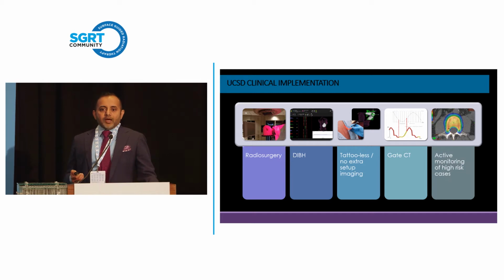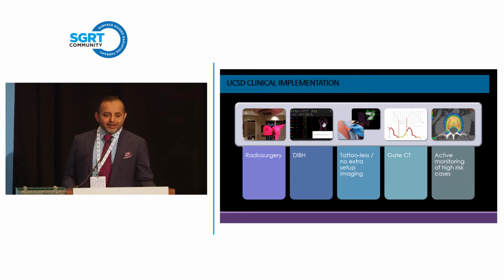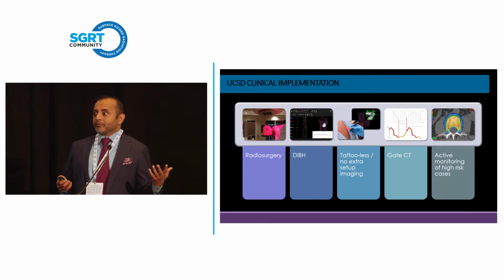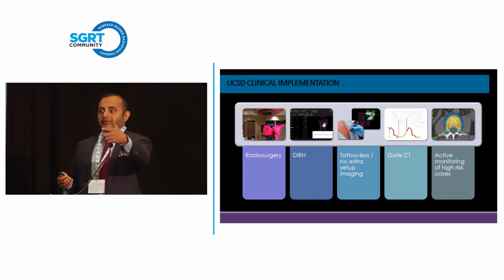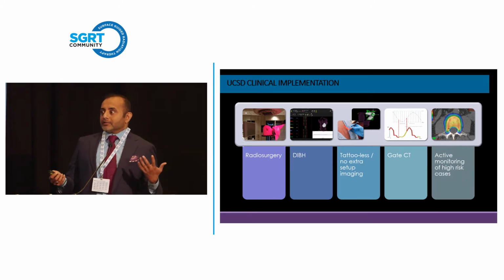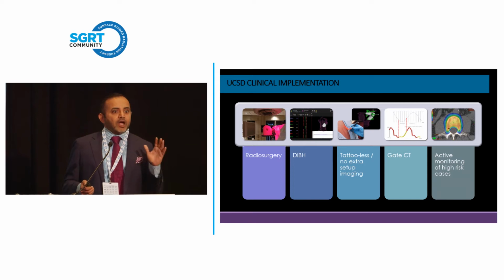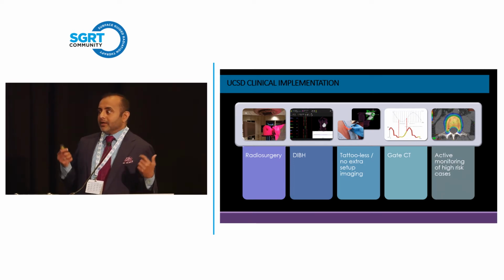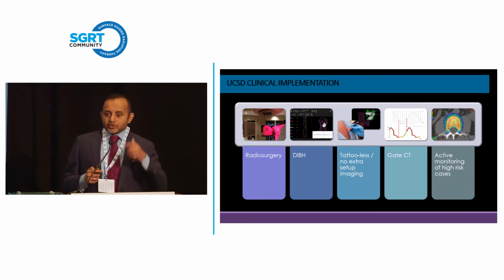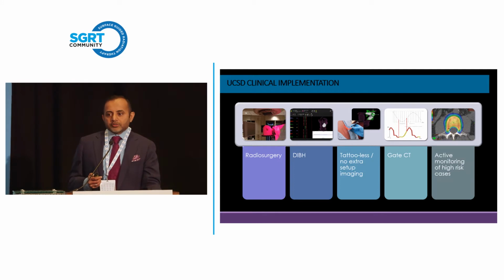So as you can imagine, in radiosurgery, compared to 15, 20 years ago, when I started practicing radiation, we used to put frames on people, right? How many of you use frames today, where you bolt somebody's head? Yeah, so minority, right? So I would say about 5% of you still use frames. So going back circa 2004, when I started my residency, I would say that number was probably 80%, right? 80 to 95% of patients had a bolted frame that a neurosurgeon would come down, bolt the frame in before you did your treatments for any kind of high-dose radiosurgery in the brain.